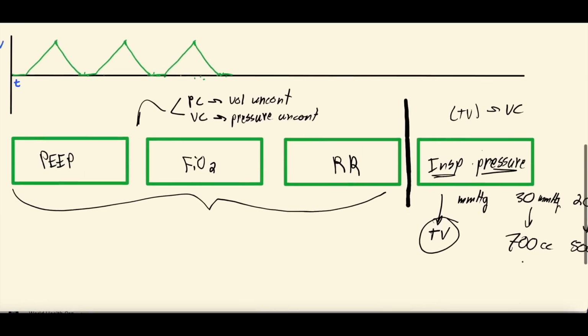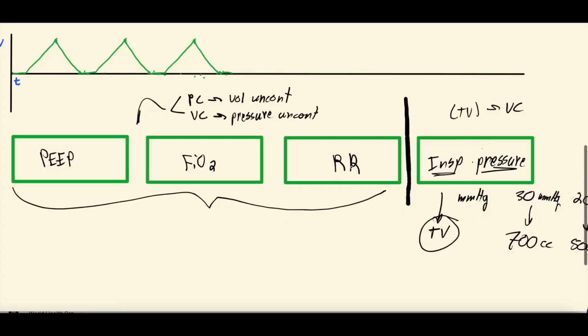And most of the time, and this is ventilator dependent, this is the pressure above the PEEP. So let's say I set this at 15 and the PEEP is at 5. That means the total pressure they're getting with each breath is 20, 15 plus 5. Again, a little ventilator dependent. Okay, so you're setting an inspiratory pressure in pressure control.